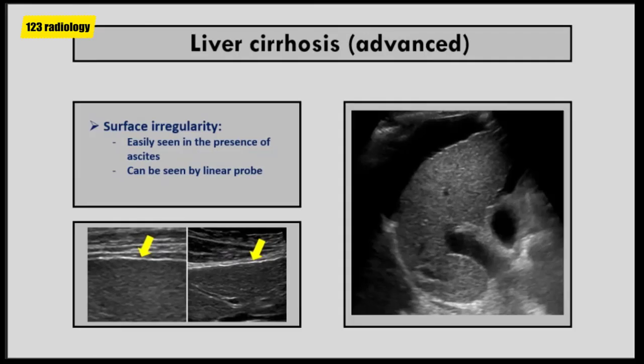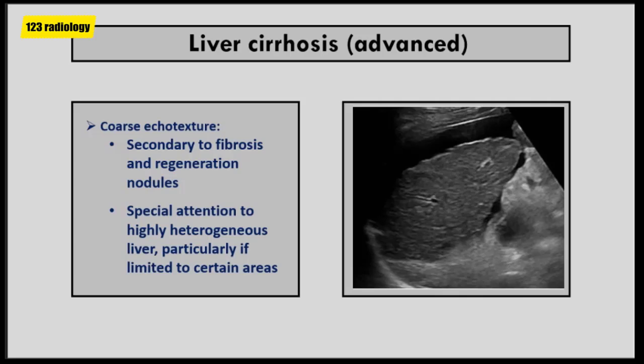Irregular hepatic surface is a sign of cirrhosis, easily identified in the presence of perihepatic ascites. Surface irregularity is due to the presence of regenerating nodules and fibrosis. In the absence of ascites, the liver surface is difficult to assess; however, this can be facilitated by using a high-frequency transducer. Coarse hepatic echotexture is seen in liver cirrhosis due to fibrosis and regenerating nodules. Special attention should be given to highly heterogeneous liver structure — if this heterogeneity is limited to certain areas, the presence of diffuse hepatocellular carcinoma should be suspected, and further evaluation by CT or MRI is recommended.